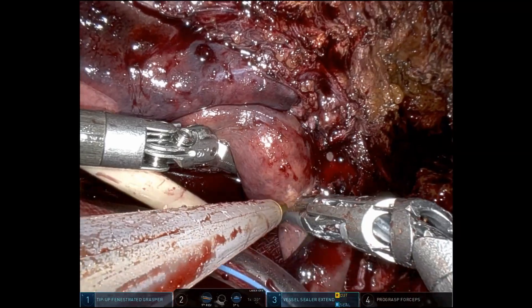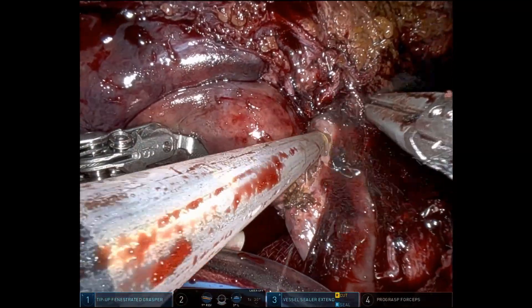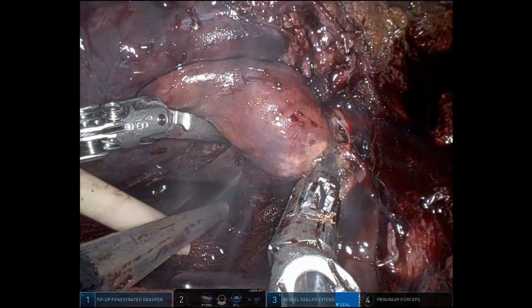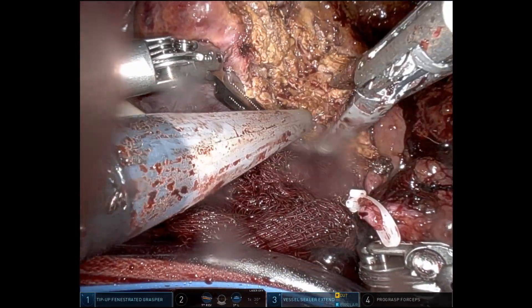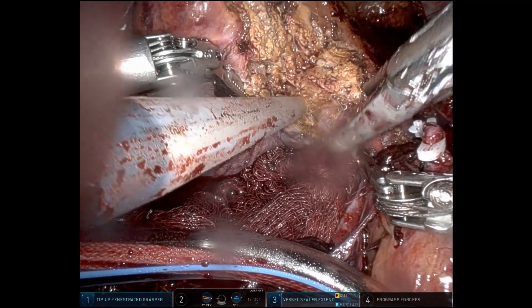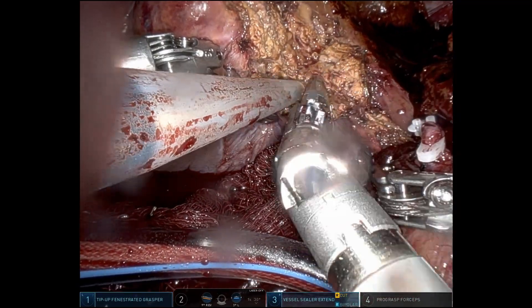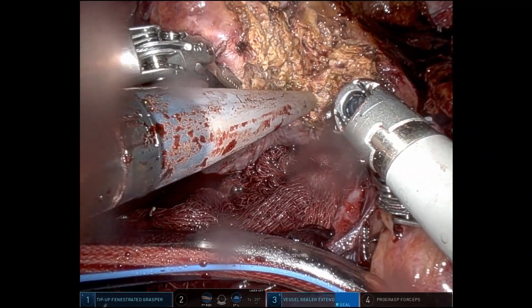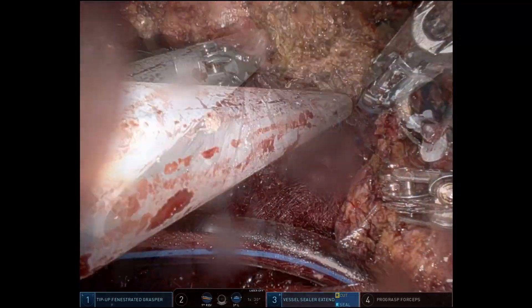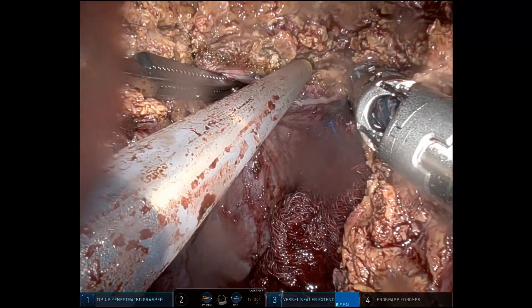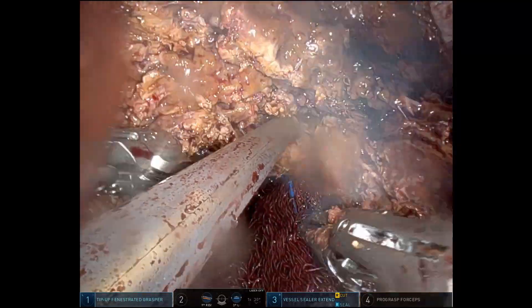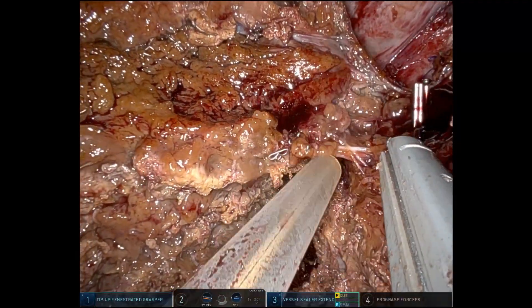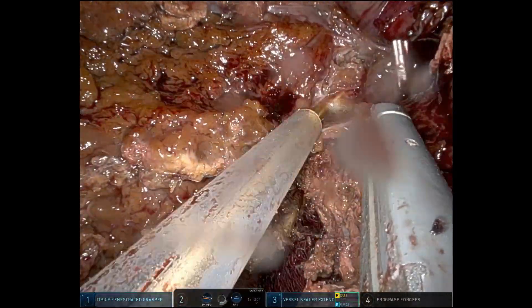You can see we encircled the right anterior sectoral bile duct there with a blue vessel loop. We're retracting the hilar duct to the patient's left to ensure that there won't be any narrowing. Now that the bile duct has been divided, we're dividing the plain transection between the right lobe and the caudate lobe. The caudate lobe is screen right. Segments 6, 7, and 8 are all to your screen left. You can see in the posterior aspect of that video the raytec that we set on the cava to protect it. Now we are moving cephalad towards the right hepatic vein.